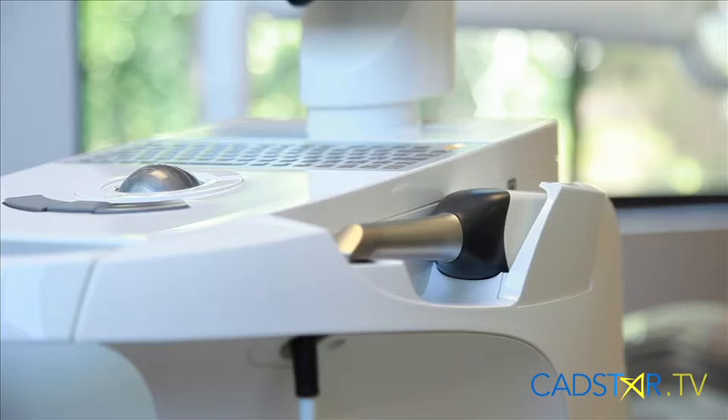Caleb is in charge of keeping our units calibrated — that's both the OmniCam, the BlueCam, and of course we have the MCXL. In fact, we have six of them here, so he stays busy with that. But the question is: when do we calibrate?